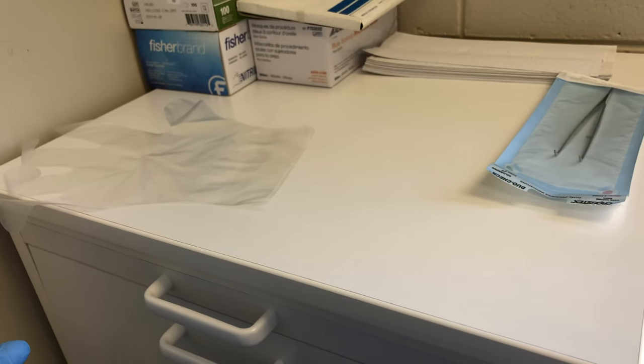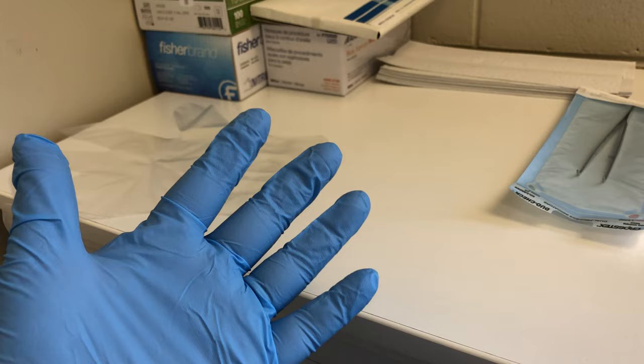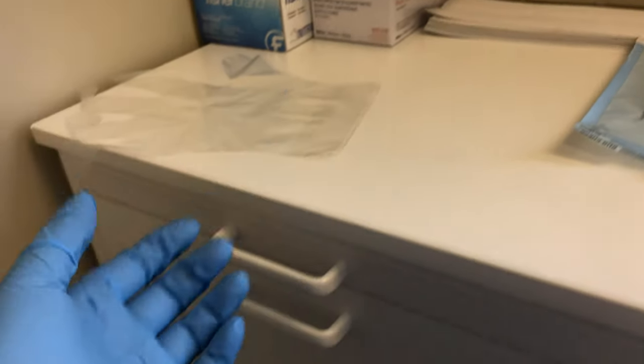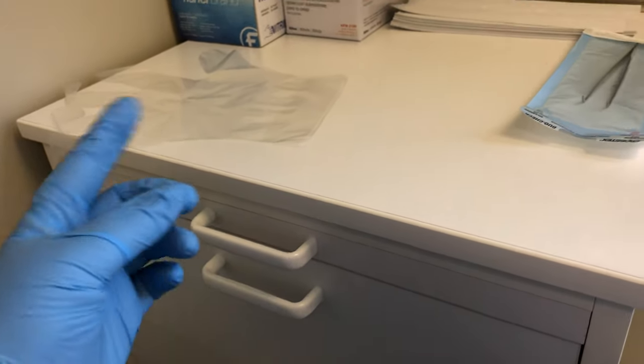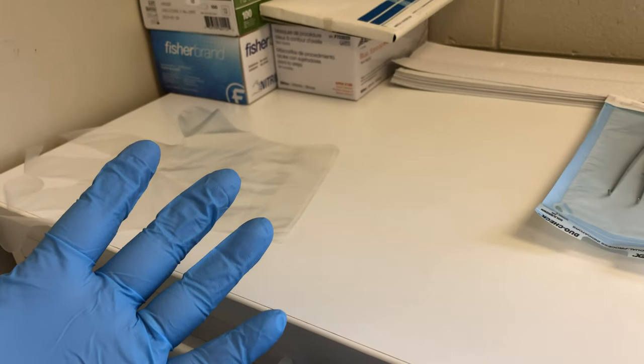There are several ways to do this. When you're chairside, these hands have been in the patient's mouth. You cannot touch drawer handles, go into drawers, tubs, or other storage bins or closets with these dirty gloves.